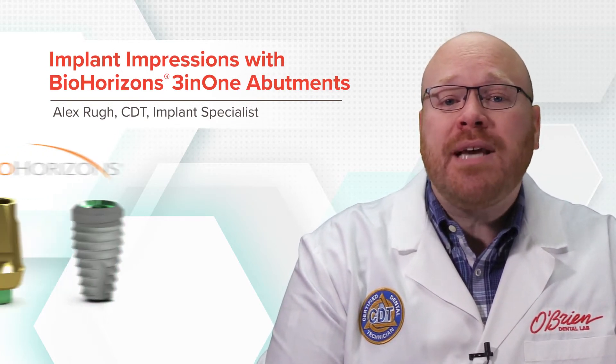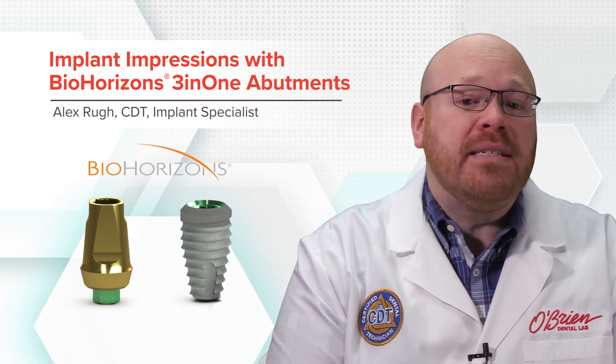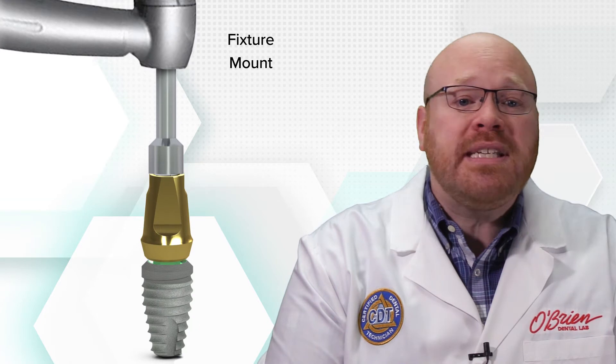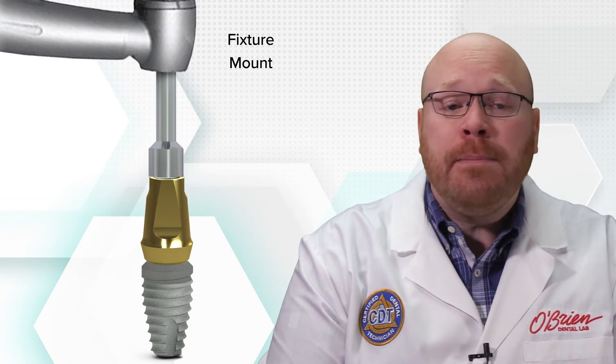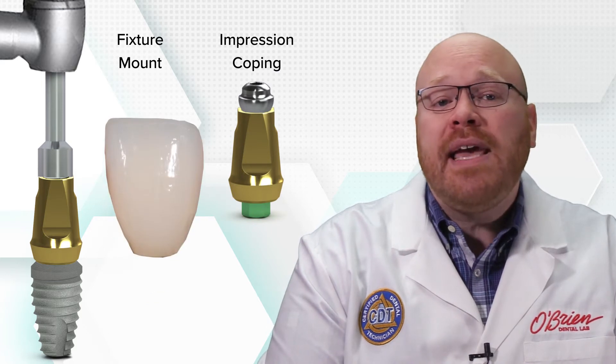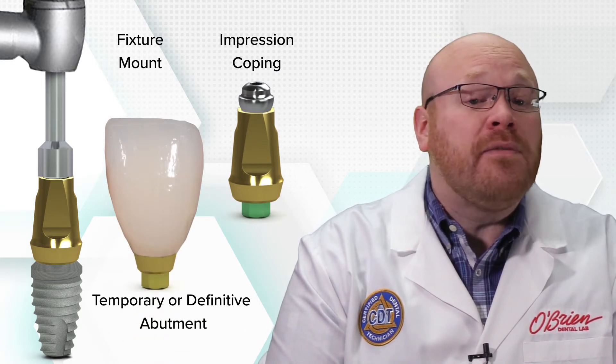The 3-in-1 abutments come packaged with many of the BioHorizons implants, and as the name implies, they serve three functions. First, they're used as a fixture mount for placing the actual implant. Second, they can be used as an impression coping. Finally, they can be used as either a temporary or definitive abutment.